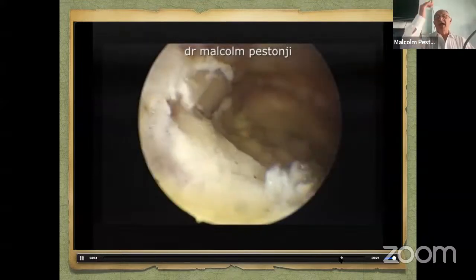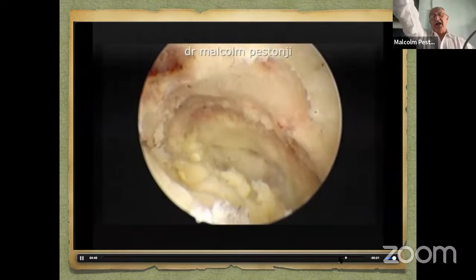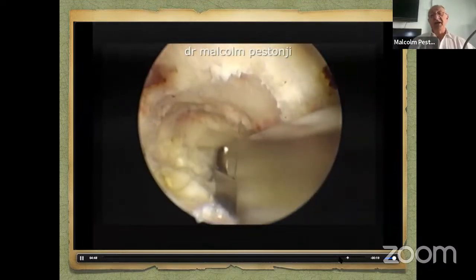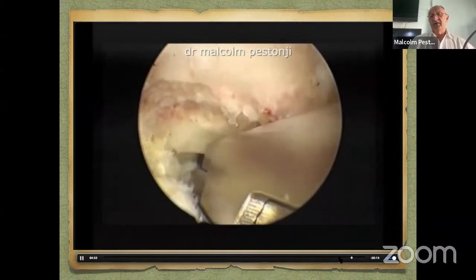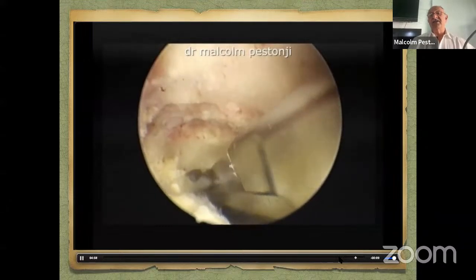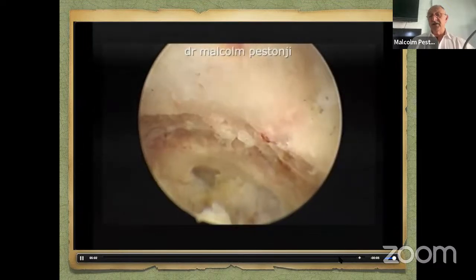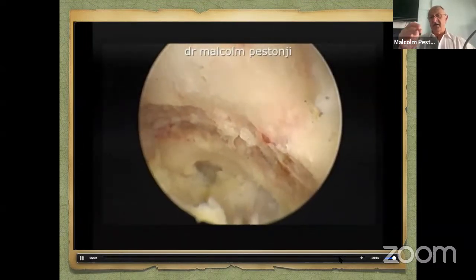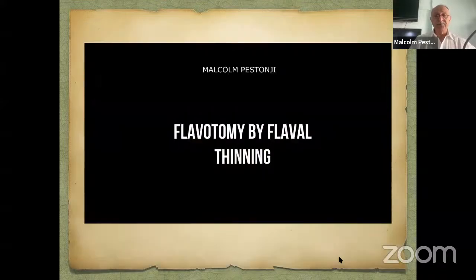So now you see the whole lamina on top of you is intact, right from the superior laminar edge to the contralateral foramen. You have retained the entire bony structure of the contralateral lamina. You have not sacrificed bone to reach the axilla or the foramen on the opposite side. So when it comes to decompression, going under the lamina, cutting into the opposite side, clearing up the lateral recess, this is an advantage. And we have done it completely extraforaminally.